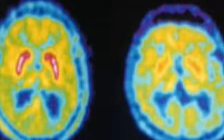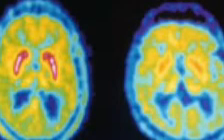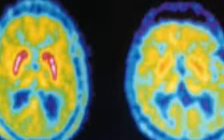Results. Images of PET scan combined with CT scan. Pictures from a PET scan display bright spots where the radioactive tracer collected. These spots reveal higher levels of chemical activity and details about how your tissues and organs are functioning.